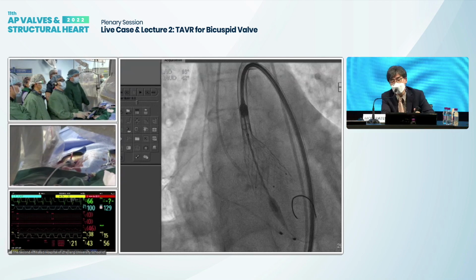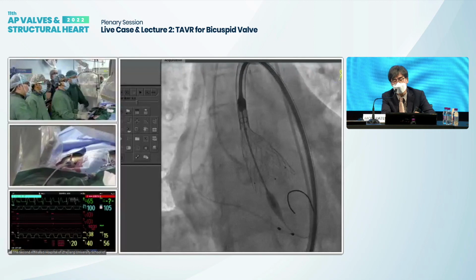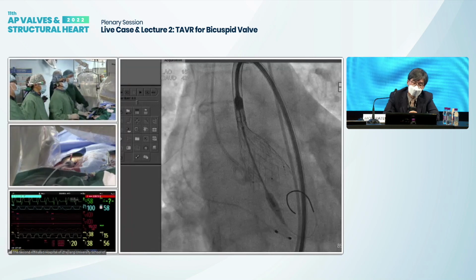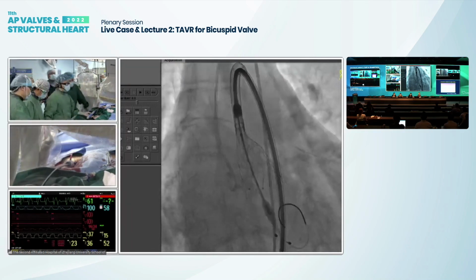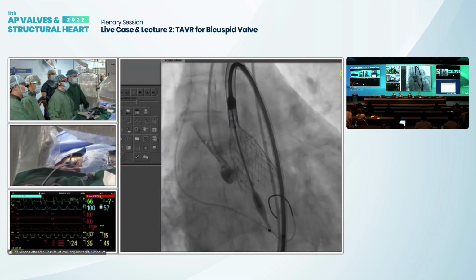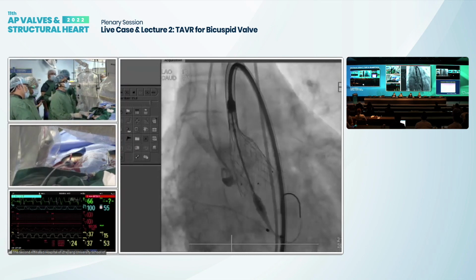If it is available, could you show us the angiogram? How deep it is? You know, obviously, the height now is too deep. So the AV conduction has disturbance. Yes. Too deep. Agree.